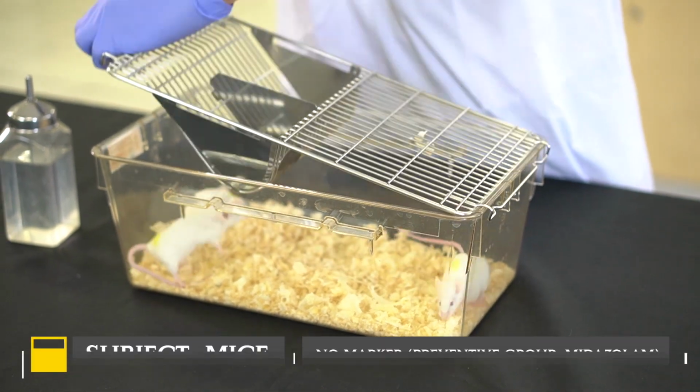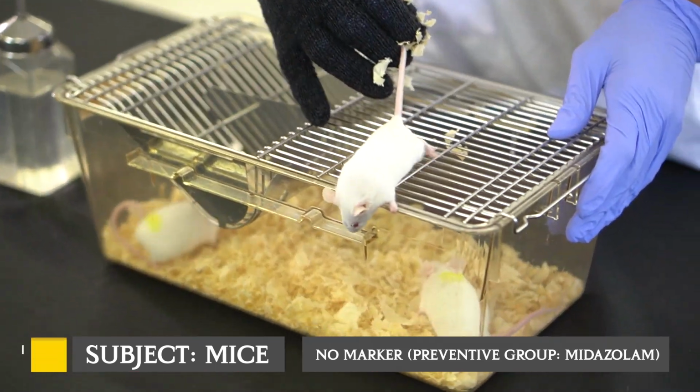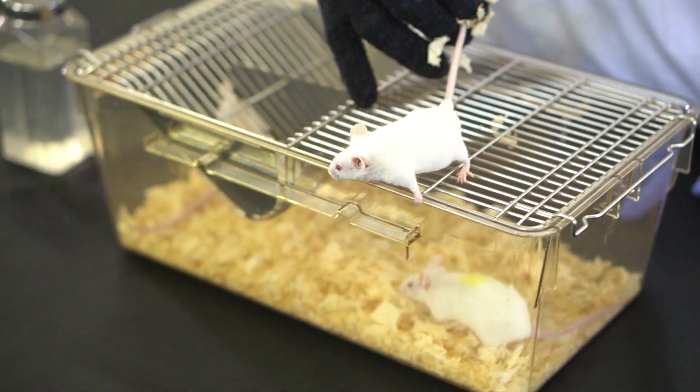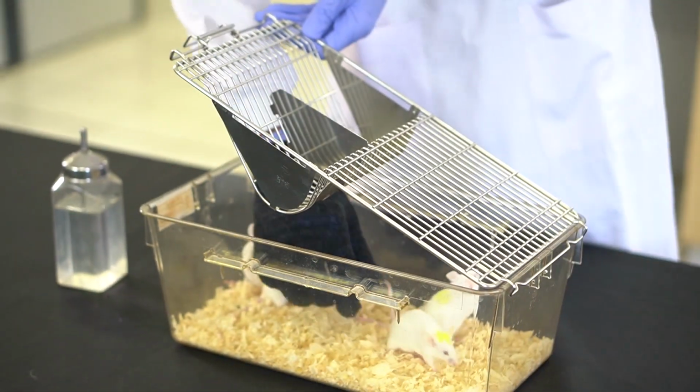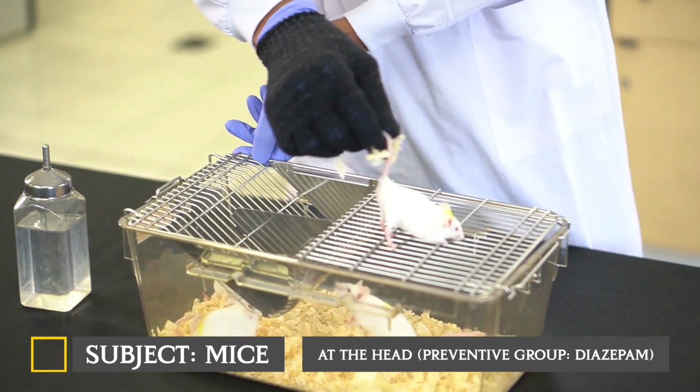Mice without marker. Preventive group midazolam. Mice with marker at the head. Preventive group diazepam.